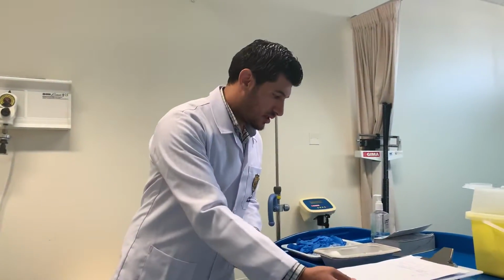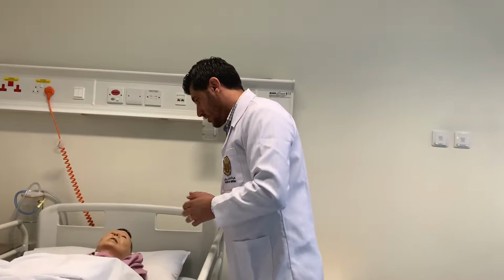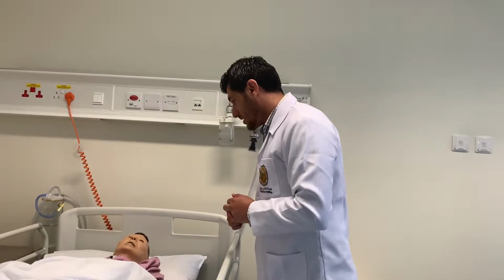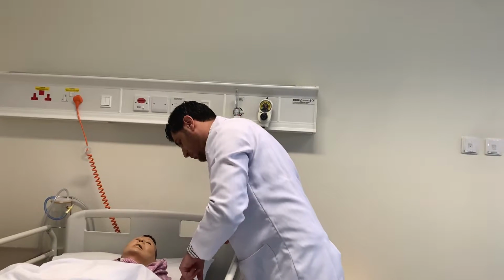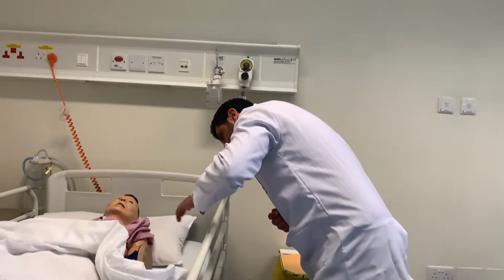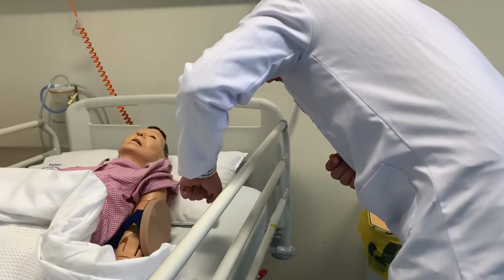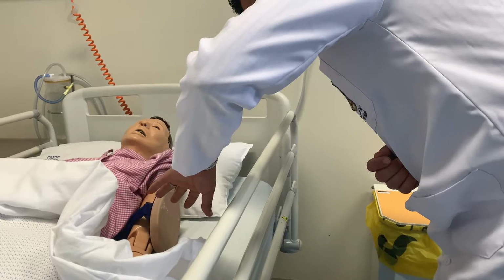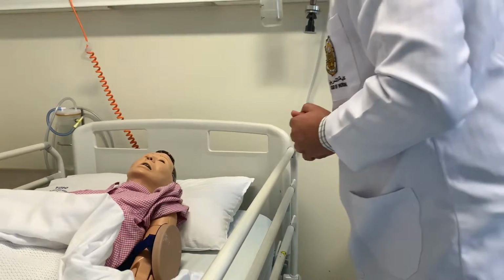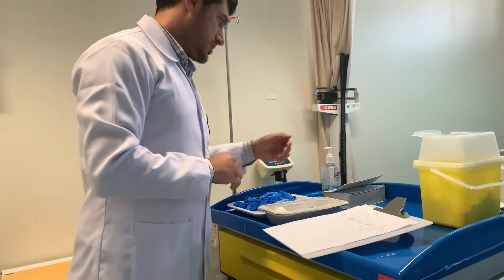But before we start the injection, please let me know where the last site of this injection was. Did you have it yesterday? So you didn't, yes. But the day before you got it here, so okay, we will choose this hand to give it today to ease the pain. But let me see first if you have any bruises, ecchymosis, or scars. Yes, it is clear. There are no bruises, no scars, no hematoma, so we can give the injection in this site. Now we are preparing the medication itself.